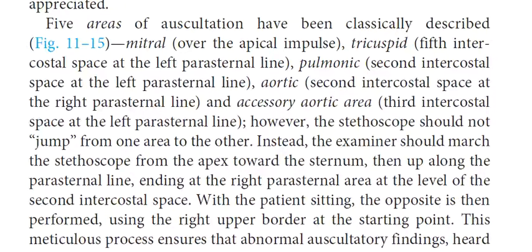However, the stethoscope should not jump from one area to the other. Instead, the examiner should march the stethoscope from the apex toward the sternum, then up along the parasternal line, ending at the right parasternal area at the level of the 2nd intercostal space.